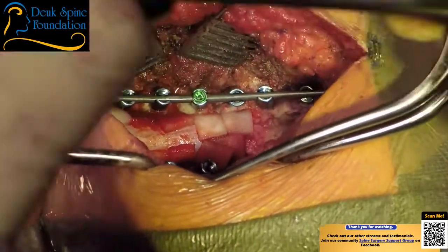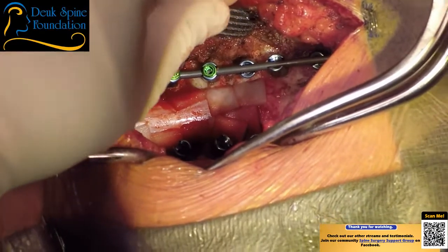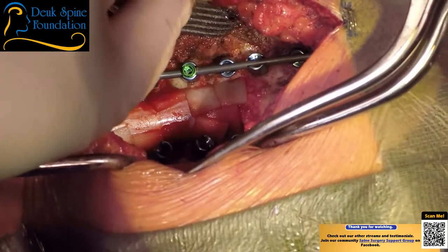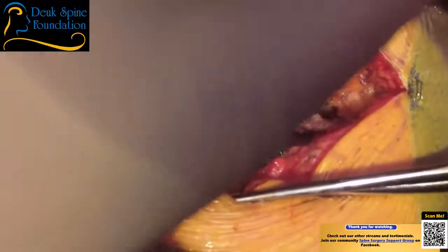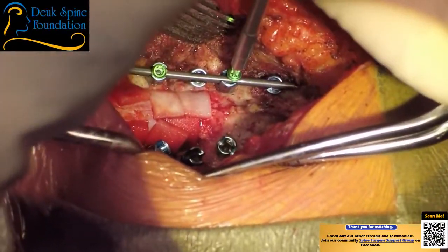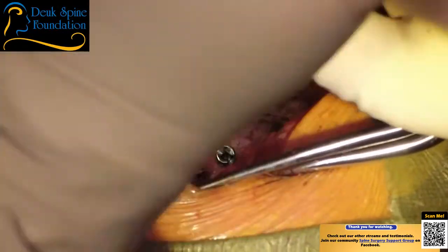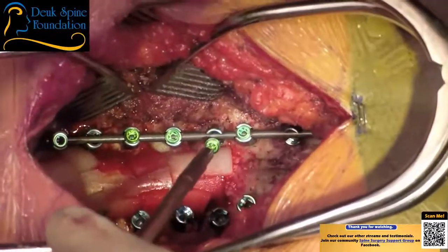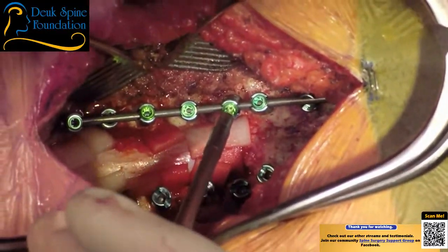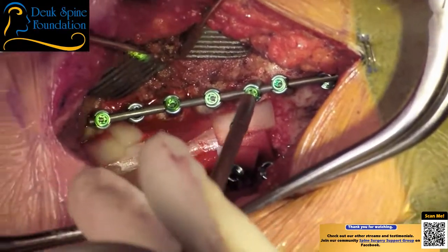Some surgeons actually do the bone work. Everyone does this differently, okay? Some put hardware in first, then take the lamina out or do the bony work. I do it this way because I think this is, in my opinion, the best and safest way of doing it. It doesn't mean someone else's way isn't right. I always say there's 1,000 ways to do a fusion, and about 3 of them are right. The rest are wrong. But that leaves room for 3 different techniques.